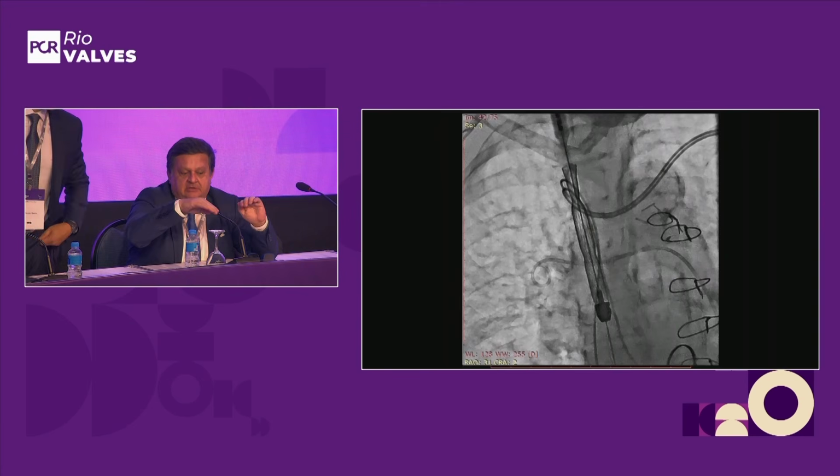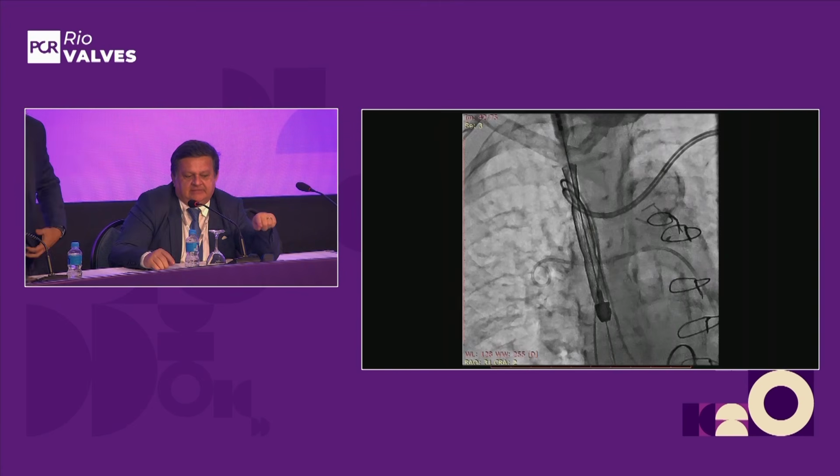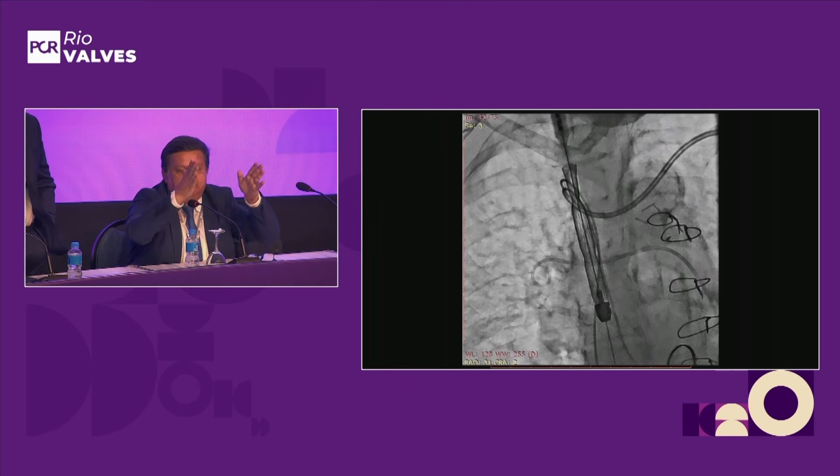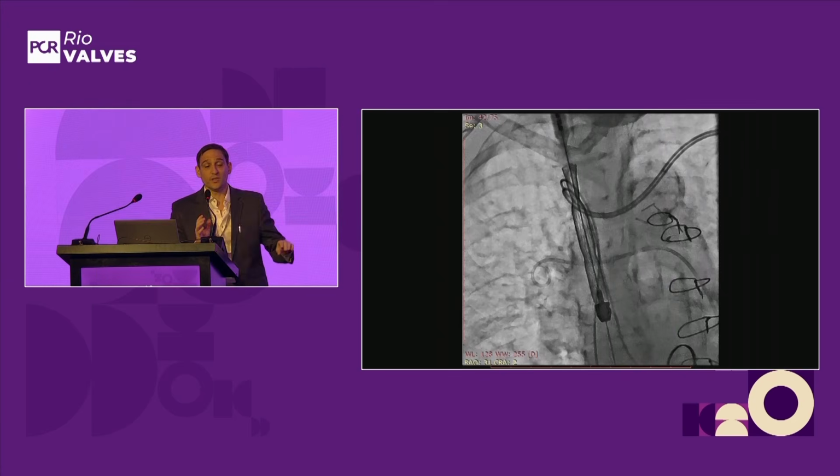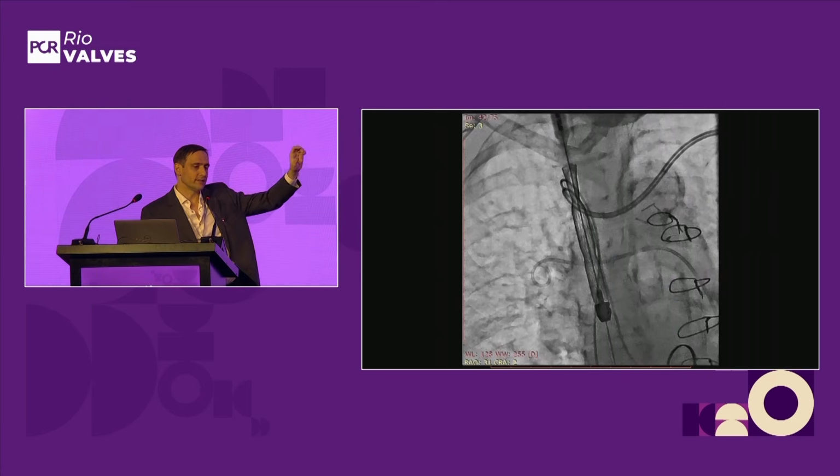But if it's the right place, it's exactly the point, because you can put the pigtail in this depression below the belly after the release. So you must try to keep this position at the end. It should be nice. So it's a good point to start. If you see, the device has a belly that now is closed, but you see a small waist that is just above the catheter. That is the right place to deploy the device.